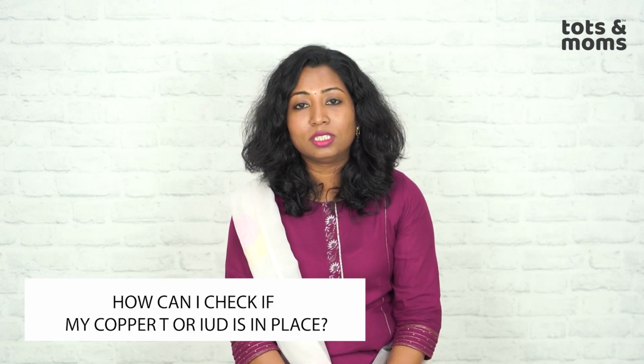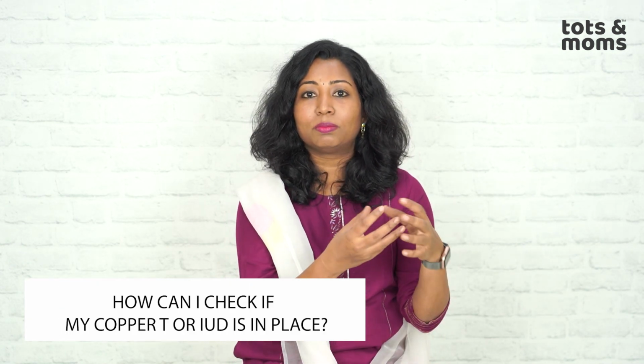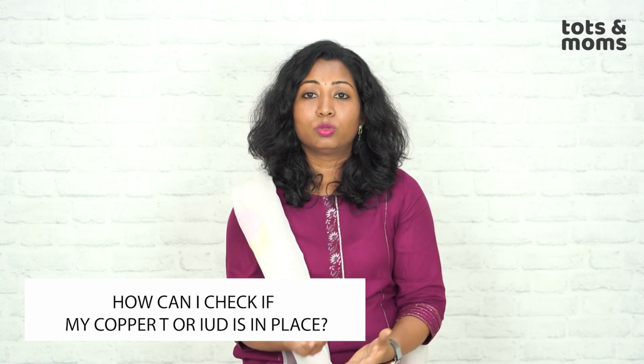And the last question is, how can I check if my copper T or IUD is in place or not? Now, even while using a menstrual cup, if you pull it down and you don't know, please watch for it. Please check your pads, or a simple way is to put your two fingers in the vagina and test it. Do not do it often. There are chances of getting infection.